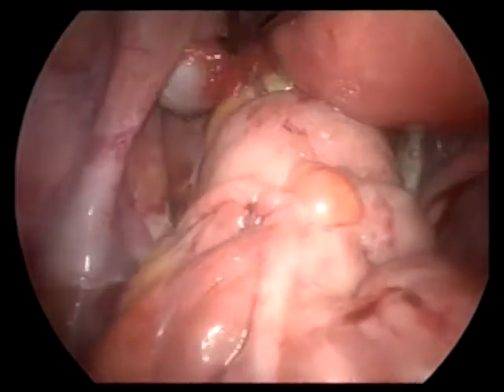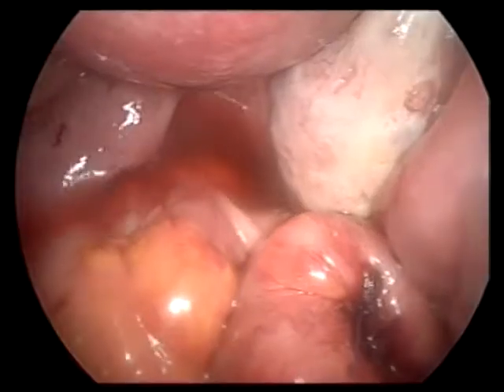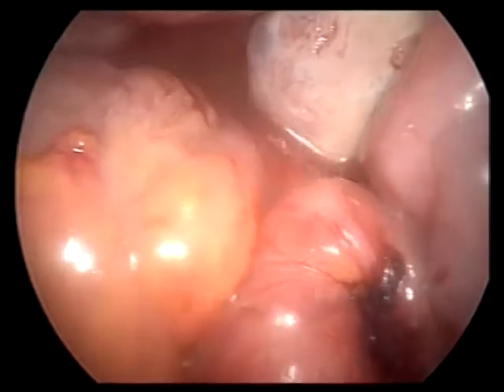The procedure ends with the hydropneumatic test and the fixation of the cecum to the left side of the pelvic wall.